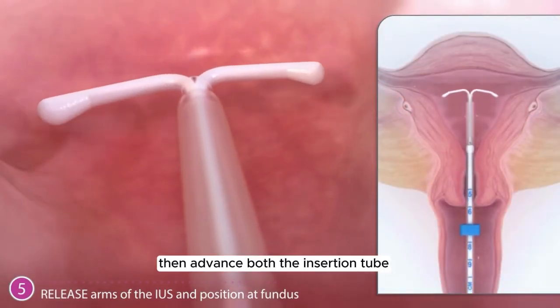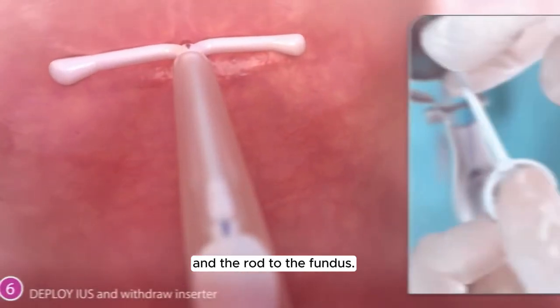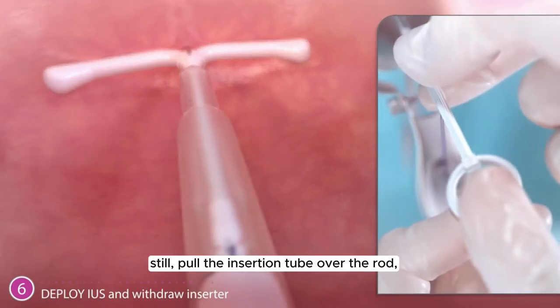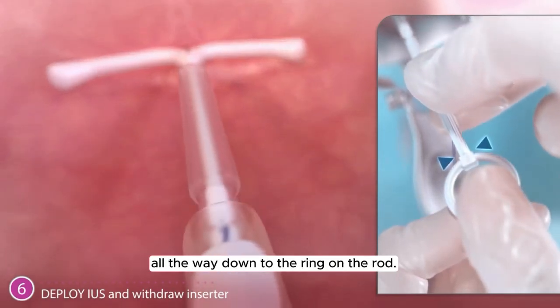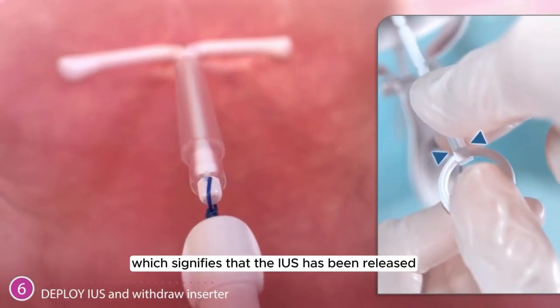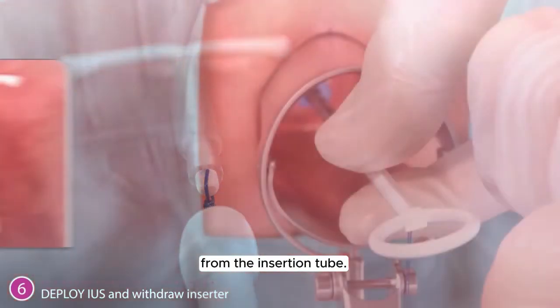Then advance both the insertion tube and the rod to the fundus. Holding the rod still, pull the insertion tube over the rod all the way down to the ring on the rod. You should feel a pop, which signifies that the IUS has been released from the insertion tube.